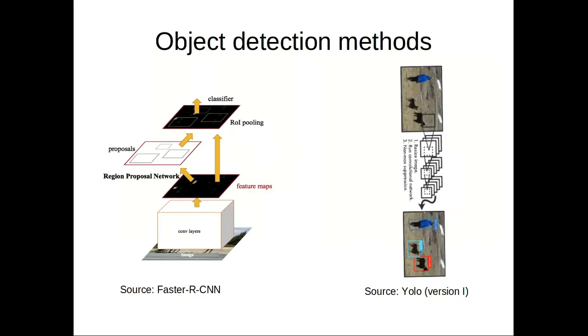Object detection algorithms could be crudely divided into region proposal versus non-region proposal methods, and also into anchor-based versus anchor-free methods. So, what type of method should we choose for our main implementation for this specific medical imagery related project? The state of the art in object detection is still, in general, region proposal based methods, such as the well-known Faster RCNN algorithm. But the non-region proposal methods, such as the YOLO algorithm, are starting to catch up and close the gap.